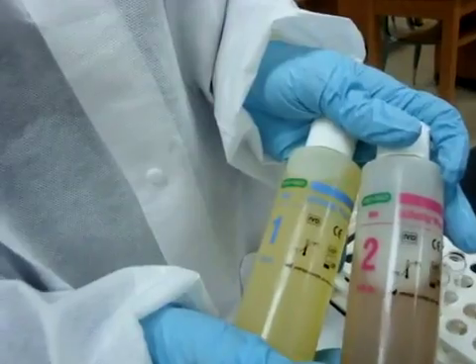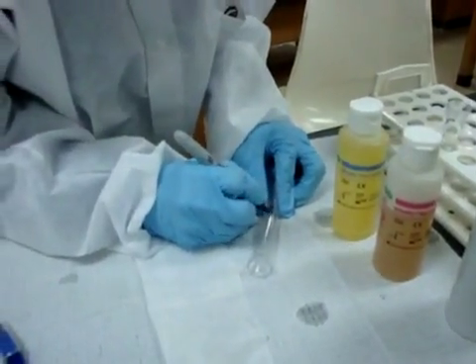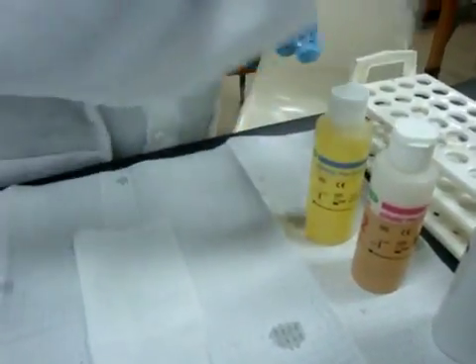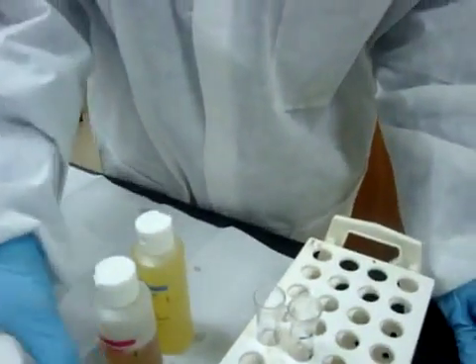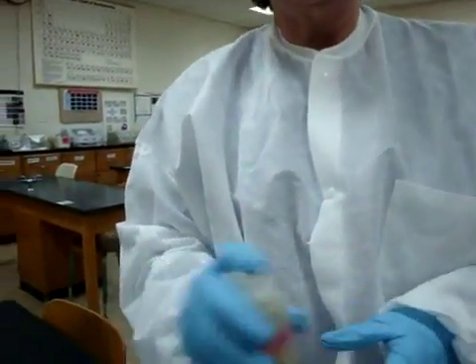Why do we do quality control? Well, we want to be sure that our dipsticks are working. So we have to prove that they're working by doing our quality control. We're going to label the tubes with negative quality control, and then this one has already been labeled with a positive quality control. And I will add the quality control material to these containers. Of course, I will mix them, and you always want to let them come to room temperature.